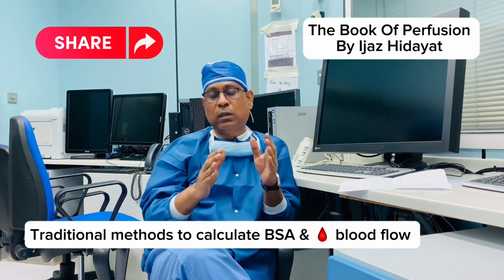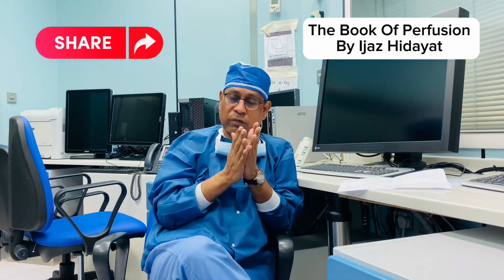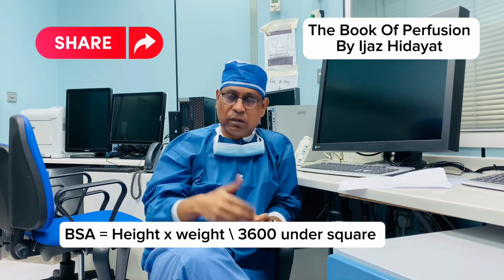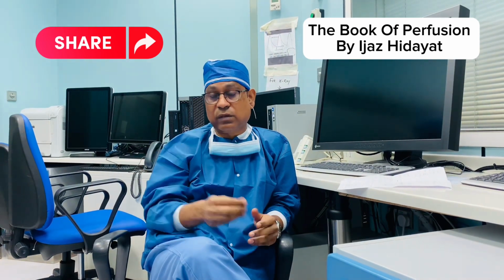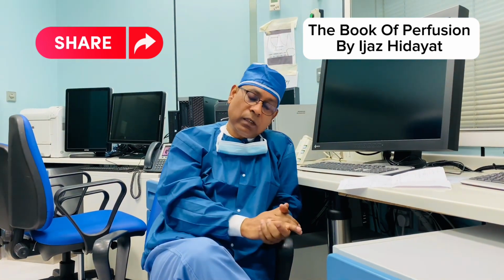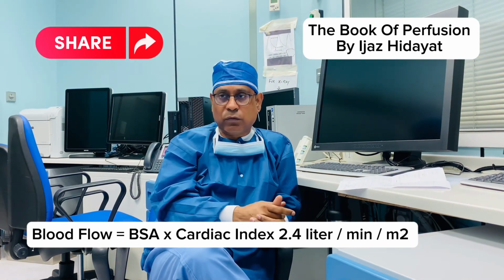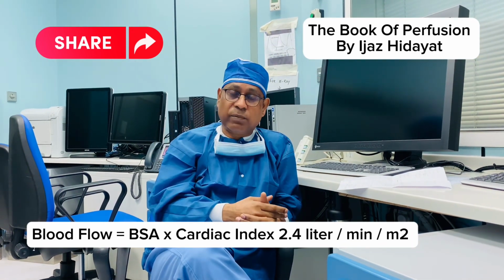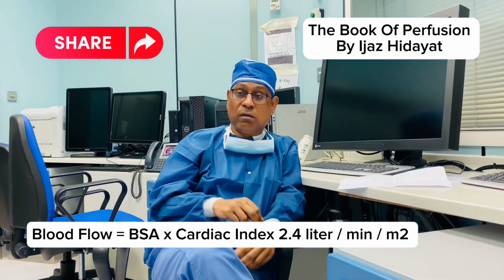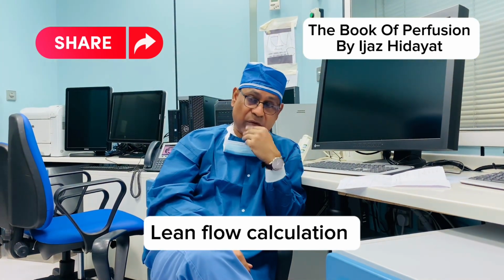If we go with the traditional method, like the Mosteller method, we do height times weight divided by 3600 and take the square root, and we get the body surface area. With the body surface area, we calculate with the cardiac index, and normally we take a cardiac index of 2.4 to 2.8 liters per minute per meter square. So now the question is how to calculate this for overweight patients, for example 125 or 130 kilograms.